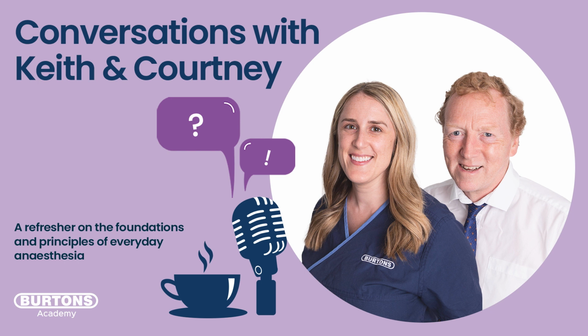Once that volume is delivered, inspiration stops, and that allows expiration. In other words, the valves open to allow the patient to breathe out passively. So that's volume cycling. And then there's the other concept of pressure cycling.